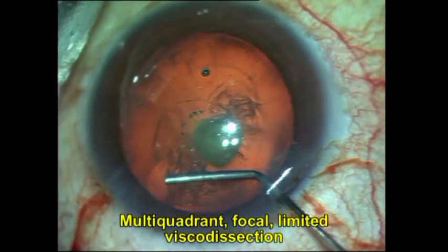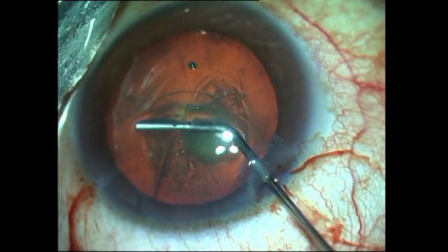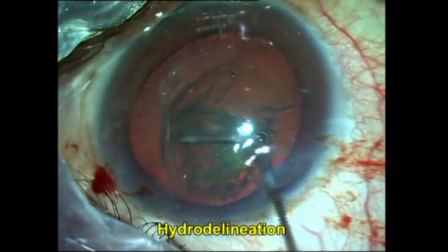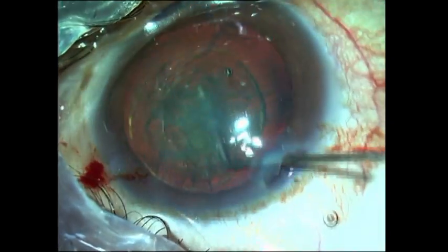The next thing I do is a multi-quadrant focal limited and very gentle visco dissection, with the viscoelastic not going further than a couple of millimeters beyond the rhexis margin. This helps to prevent an accidental hydro dissection, and of course we know that hydro dissection in a posterior polar cataract should never be performed.